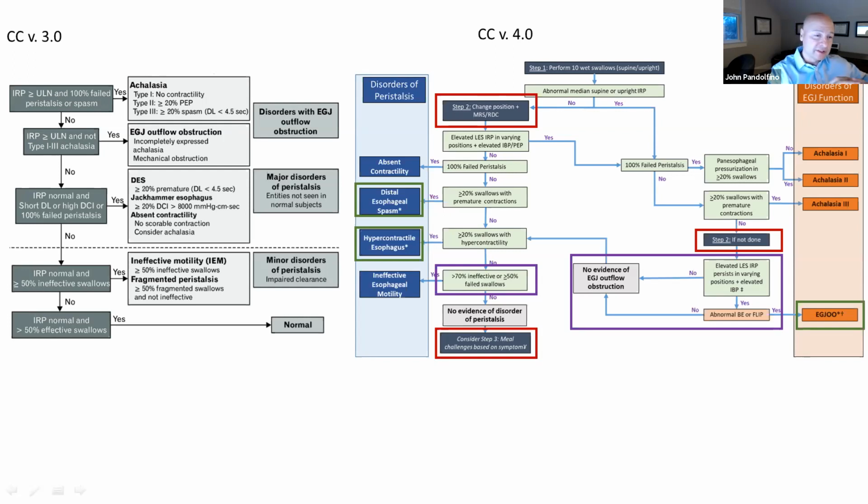Is it going to improve? Is it going to get worse? And then you will go through that. And if you haven't figured out what's going on, we leave it open in the end for some more provocative swallows. And that could even be a solid test meal if you're really concerned about dysphagia and obstructive symptoms.